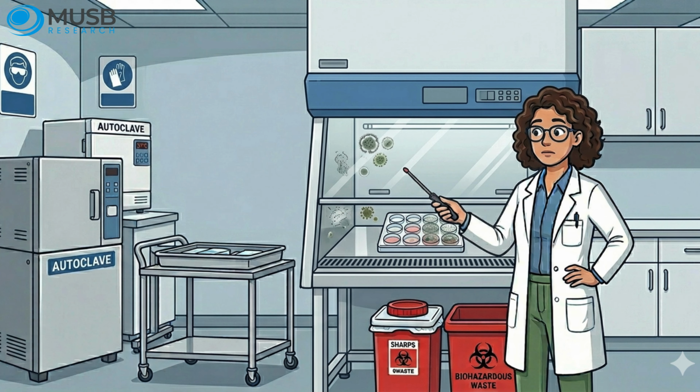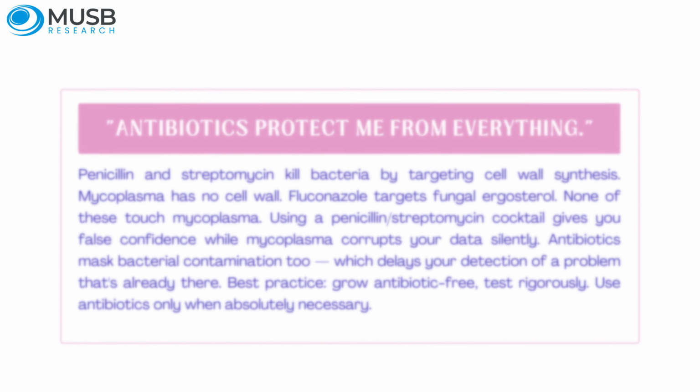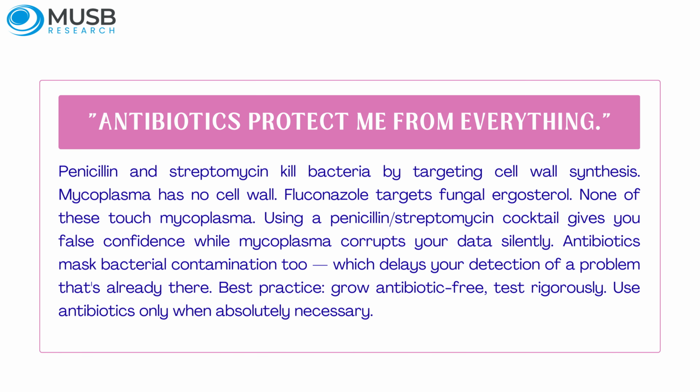Let's do a rapid-fire mistake clinic. These are the 4 habits I see most often that lead directly to contamination, and the thinking errors behind each one. 1. Antibiotics protect me from everything.